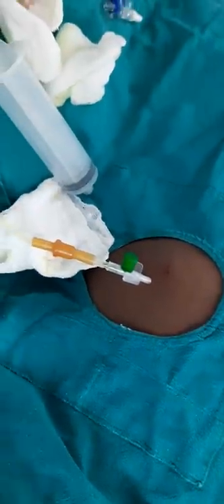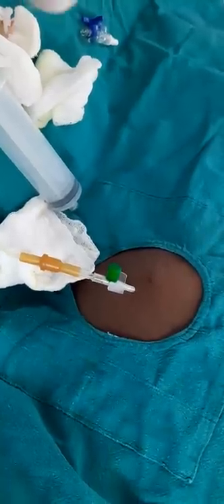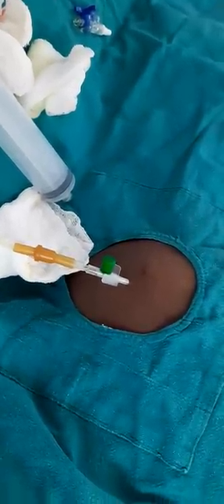This is the ascitic fluid tapping. The sample will be collected and sent for: albumin (to calculate SAAG), protein, glucose, ADA — to determine if the etiology is tubercular — cytology and malignant cell/cell block in case of carcinoma or metastasis. Also gene expert, AFB culture, acid-fast bacilli staining, gram staining, and culture.